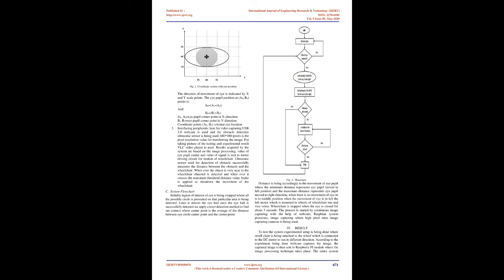With the help of the webcam, images are captured and transferred to the Raspberry Pi. In parallel, the OpenCV library is installed on the Raspberry Pi, which supports the image processing technique. B. System implementation. The working of the system is purely based on real-time DAC, data acquisition, and operating system. A low power consuming Arduino Uno is used here.